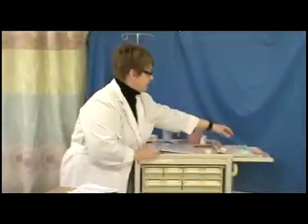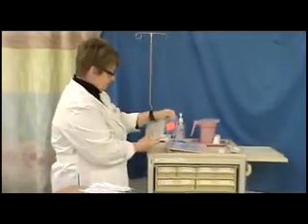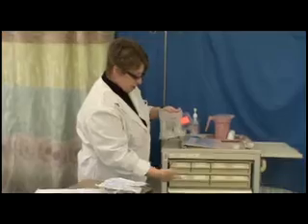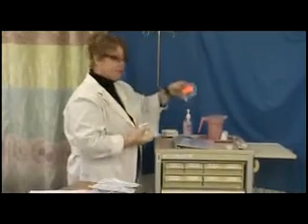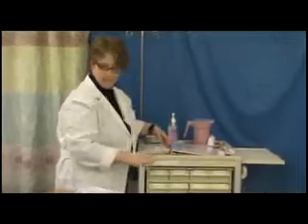So you're assembling your equipment. We're going to have our MAR. We're going to have our solutions. I'm reaching across here. What you'll have to do is, based on the order, reach in and grab the correct primary solution and the correct secondary solution. So we have these items here.